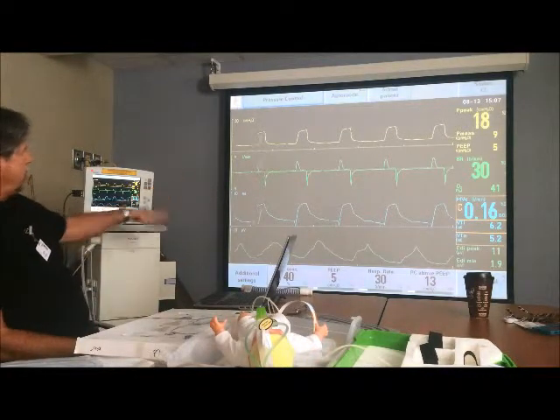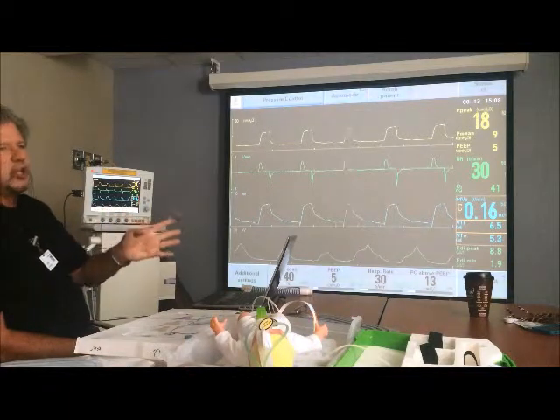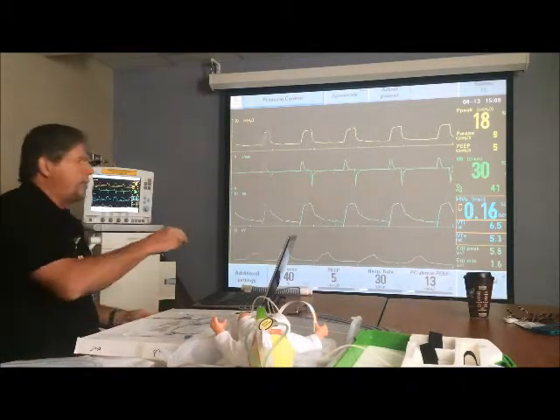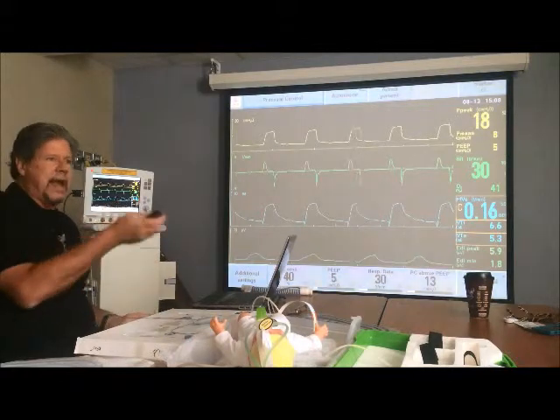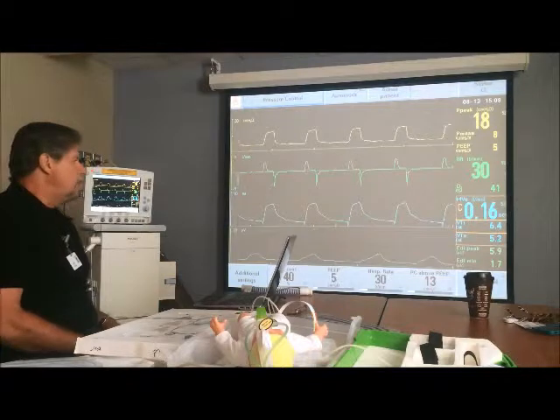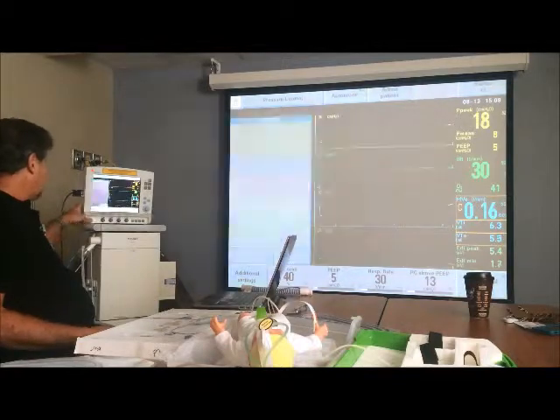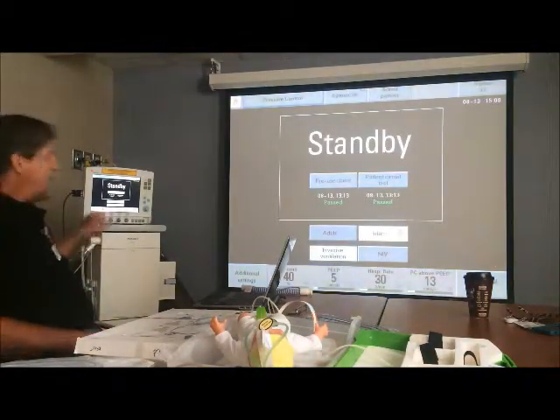So initially we look at this and go, okay, there's the EDI, and before we draw any conclusions as to whether we're right or not, this is what you would be doing. The problem that you're going to have, if we use it the way we described as just a backup, is you're not going to have this, right? But you're still going to have the ventilator to determine the proper positioning. So it's going to be more like this. Your ventilator will be in standby.